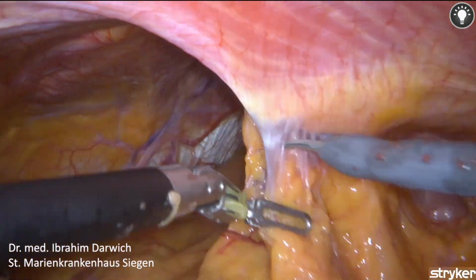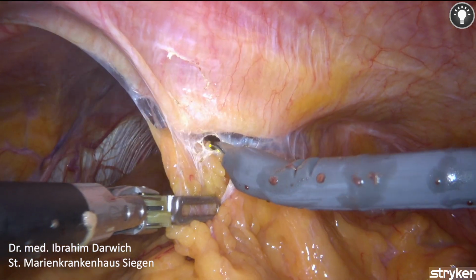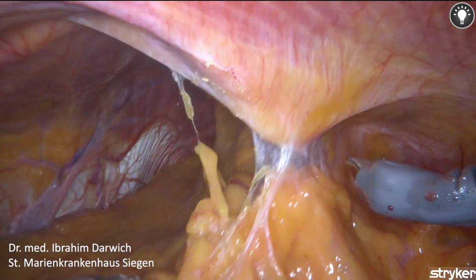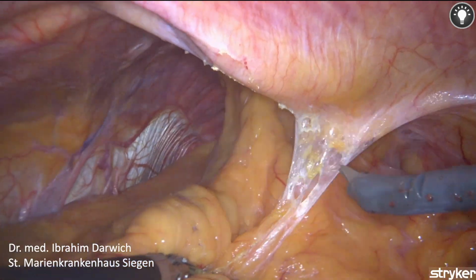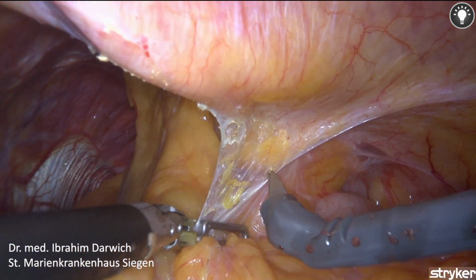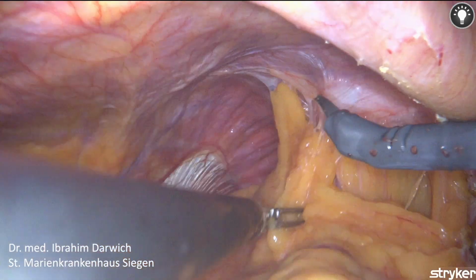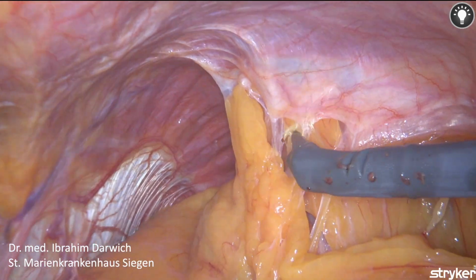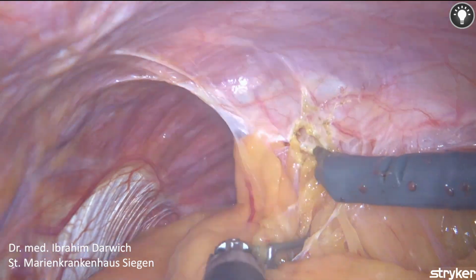The procedure is started by removing some peritoneal adhesions in the upper left quadrant. This step is performed to prepare for the mobilization of the splenic flexure, which is necessary to visualize the anterior renal fascia and the lower border of the pancreas. Once these structures are exposed, the pancreatic body can be lifted, revealing the space that houses the left adrenal gland.